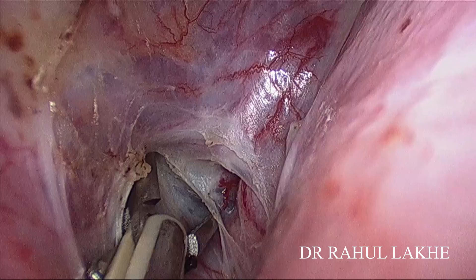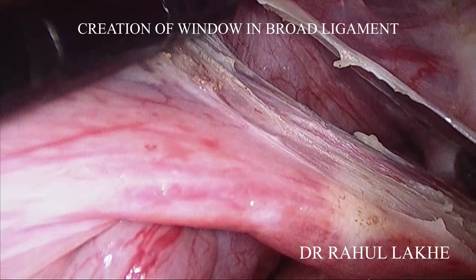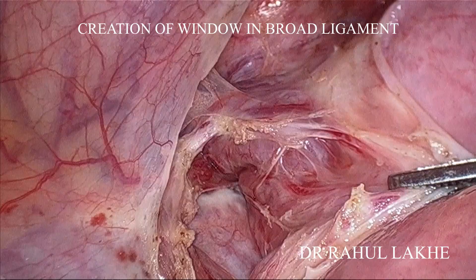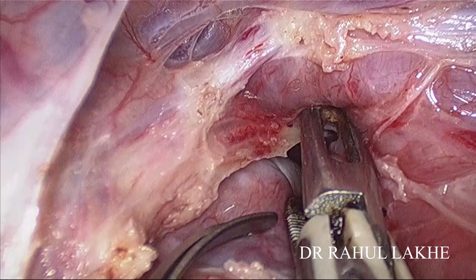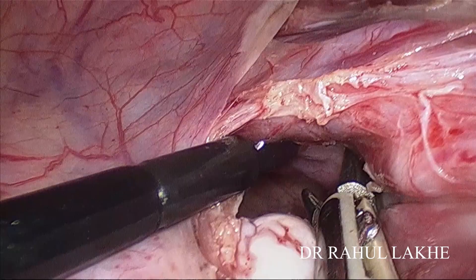The window is extended. The assistant catches the cut edge of the left broad ligament as the dissection is pursued posteriorly. The posterior peritoneum is coagulated and cut, and skeletonization of the uterine vessels is done. We feel this is the most important step — it will prevent vascular injury to the uterine bundle while passing the needle through the cervical tissue.